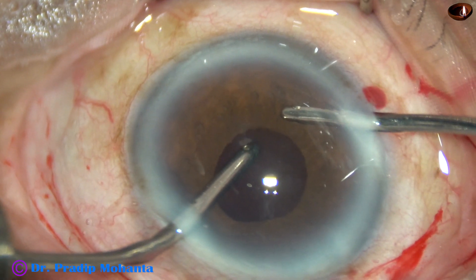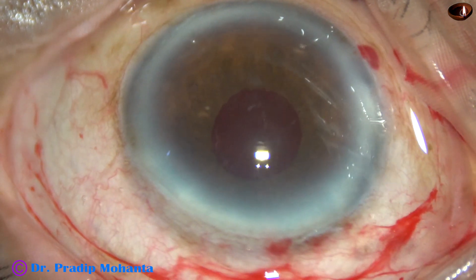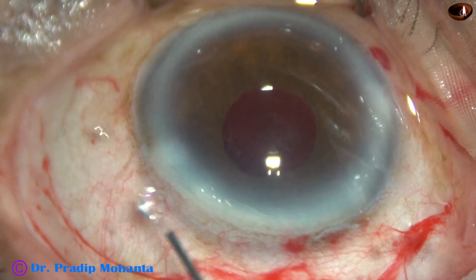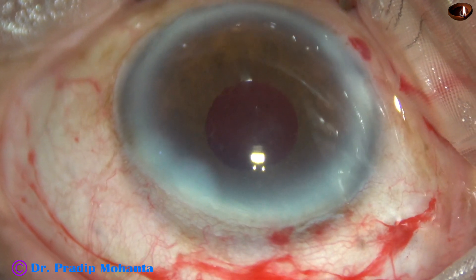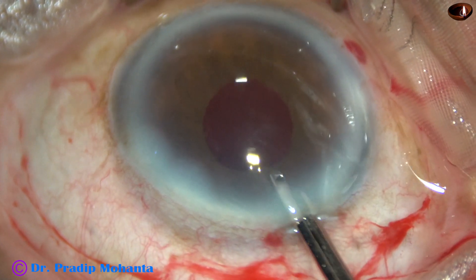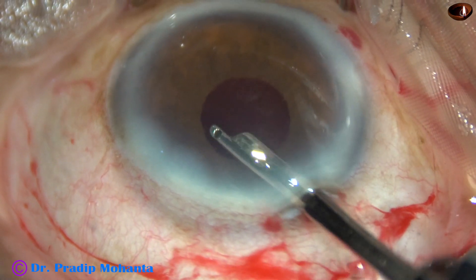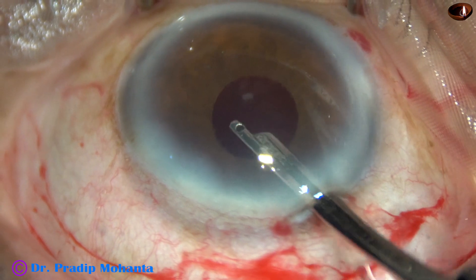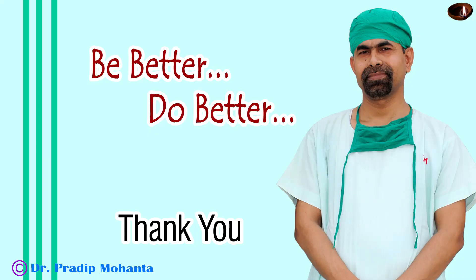And now the viscoelastic is nicely cleaned. We must devote some quality time at this stage; otherwise, we may have to face raised IOP the next day. The side ports are then closed by corneal stromal hydration. A final lavage of the anterior chamber is done with BSS, because whenever we hydrate the side ports, some particles may go inside the eye from the cannula. Thank you very much for your attention. Hope this video will help you in developing your surgical skills. Please learn to use a pupil expansion device, which may be required at any stage of surgery. Thank you.